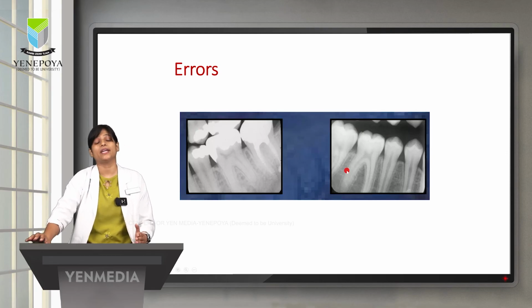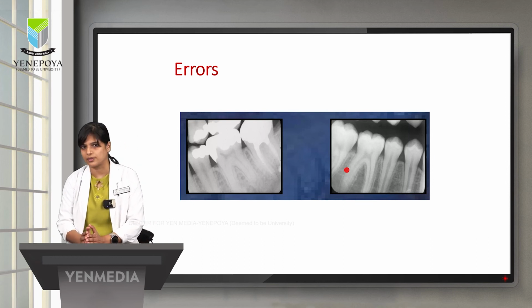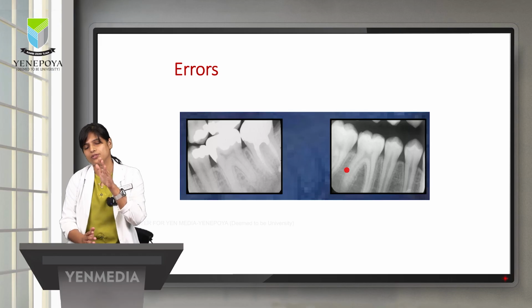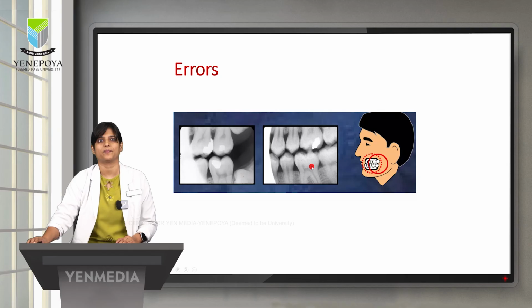This would have happened why? As I mentioned earlier, probably the film was placed too close to the palatal bone, thereby the patient would have pushed down the whole film. This is the end result of it.